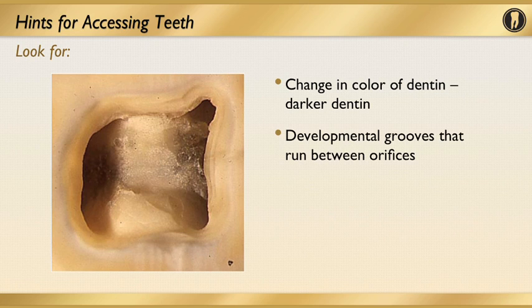Here's another example of the appearance of dentin of the chamber floor. Notice the difference in appearance, a darker, more organic appearance in the presentation of this dentin.